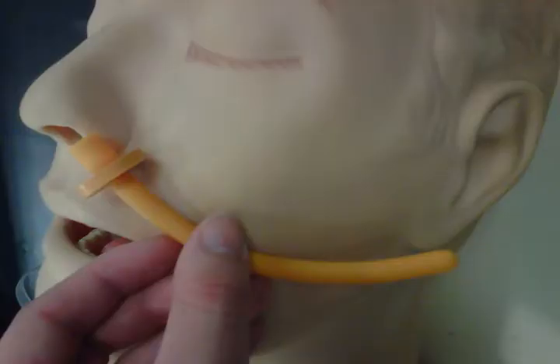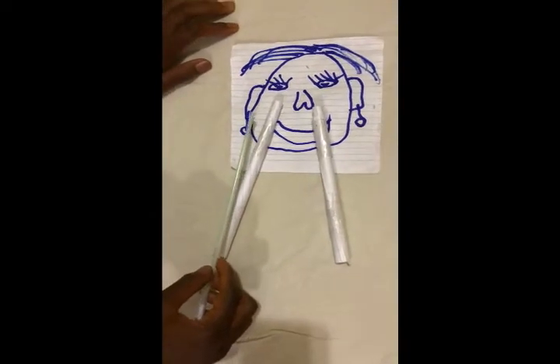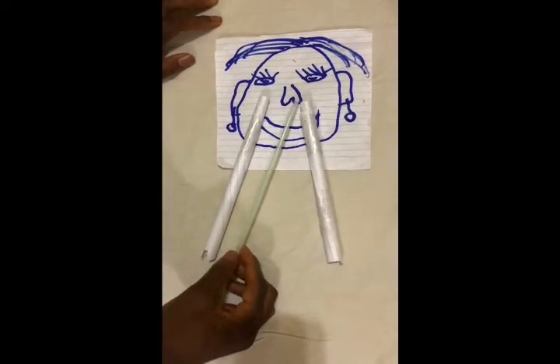After you've determined the correct diameter, you then measure the length from the tip of the nose to the tip of the earlobe, or some people measure from the tip of the nose to the angle of the jaw. You do this so you can determine the correct length.